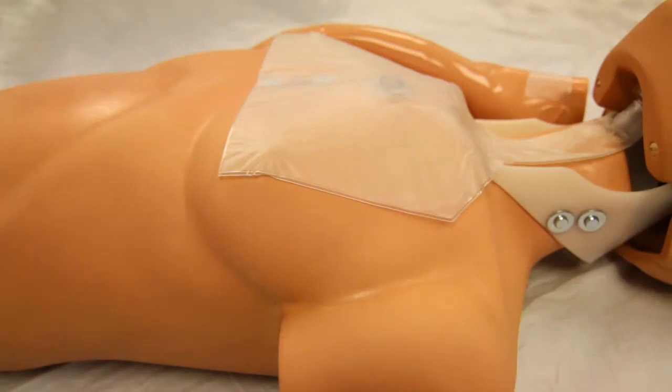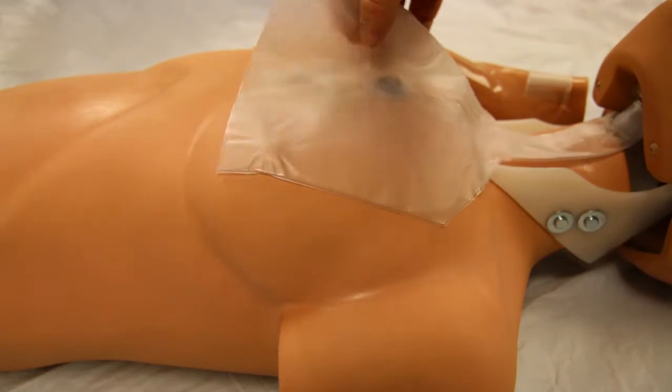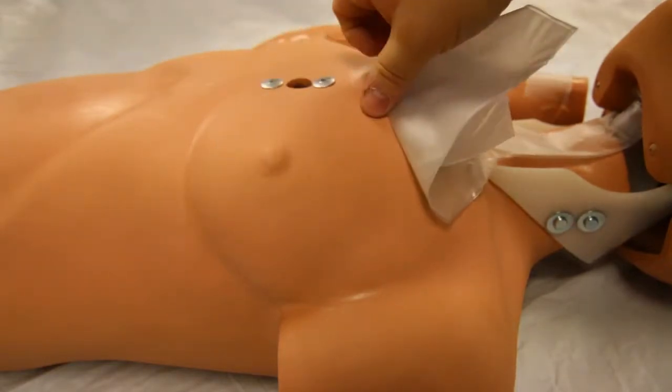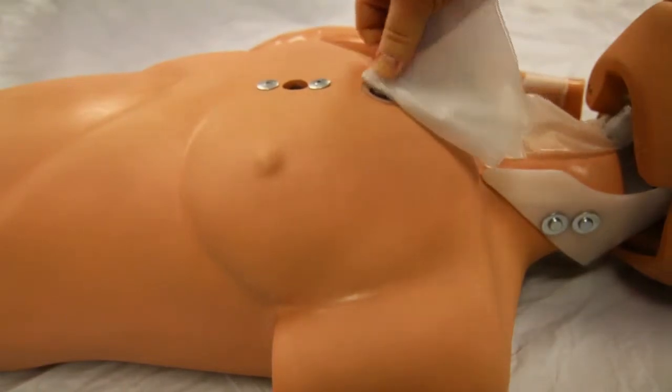Once the lung check valve is removed from the jaw, release the lung sensor connection and replace with a new lung. Reattach the lung check valve as previously shown.